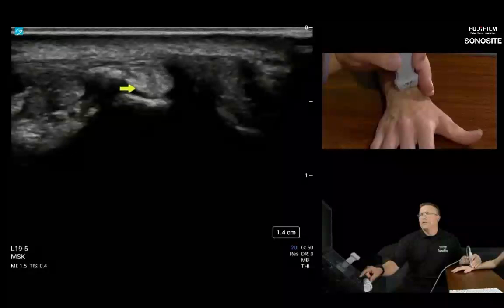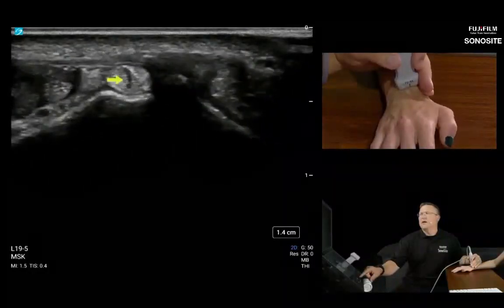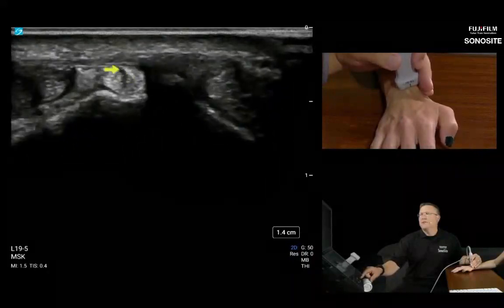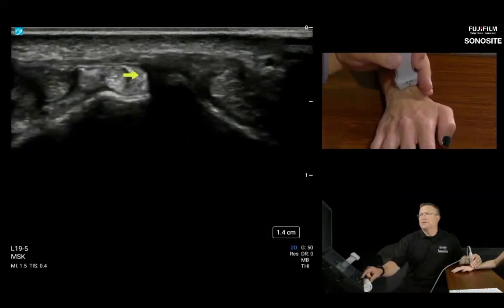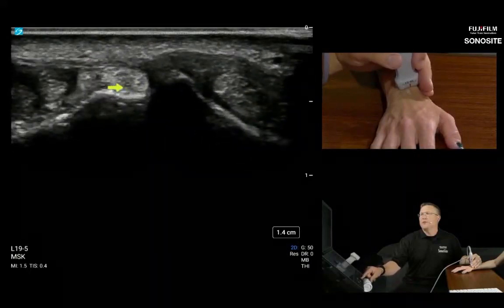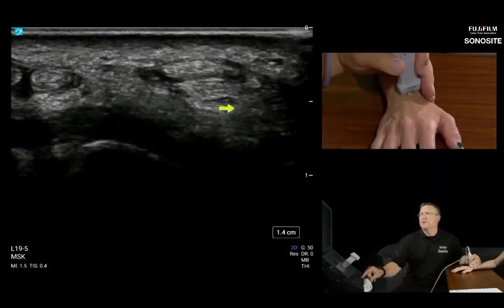And there, with 19 megahertz, we're probably seeing 2 heads of this tendon. I've never studied whether or not there's 2 heads or if that matters, but there's definitely a slip here and 2 branches of this tendon. So what I'm going to do now is, as I leave Lister's tubercle, I'm going to go distally, and I can already see that tendon try to jump over compartment number 2.